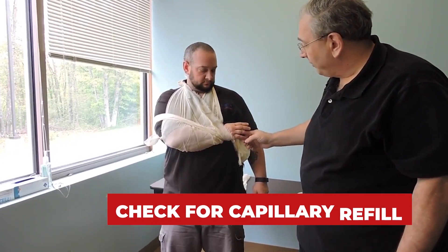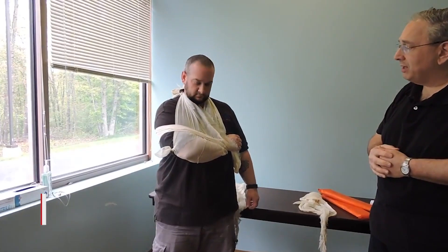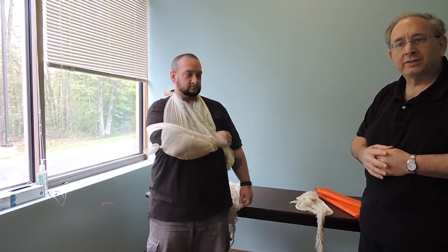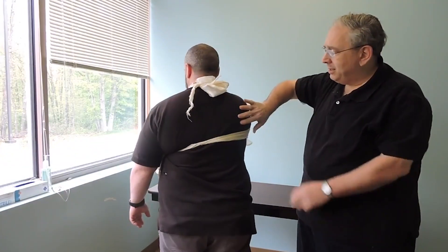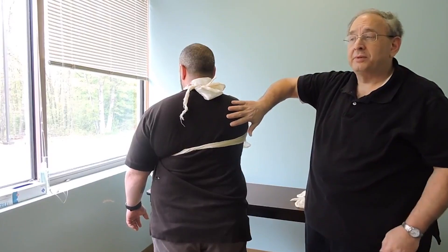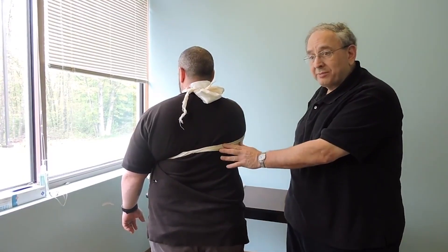And I'm going to check for capillary refill. And that's it. You have ten minutes to do this skill — most people finish in about five or less. And that's the sling and the swath, and that's good for the scapula back here. I just want to make sure that the swath does not go around over the scapula, because it would impede on that broken bone or dislocated scapula.